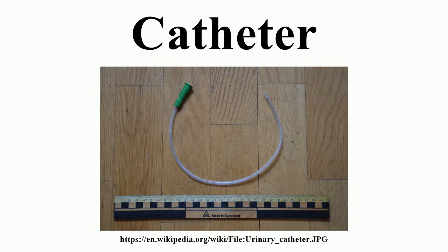In the early 1900s, a Dubliner named Walsh and a famous Scottish urologist called Norman Gibbon teamed together to create the standard catheter used in hospitals. Today, named after the two creators, it is called the Gibbon-Walsh catheter. The Gibbon and the Walsh catheters have been described and their advantages over other catheters shown. The Walsh catheter is particularly useful after prostatectomy for it drains the bladder without infection or clot retention. The Gibbon catheter has largely obviated the necessity of performing emergency prostatectomy.